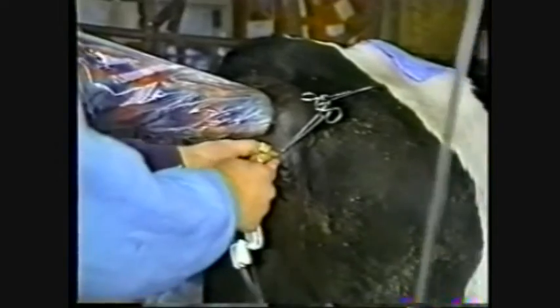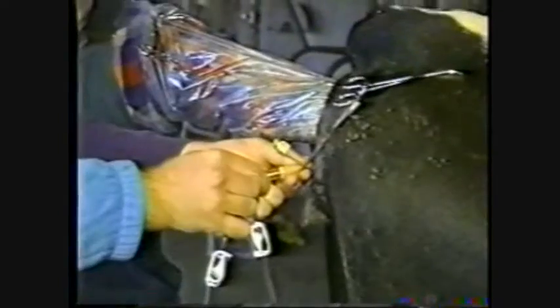Try to minimize the downward back pull on the catheter. On a downward pull with the tubing, it might dislodge and pull back the balloon. So at that stage, we're now ready to plug in the catheter to the tubing. It's good and snug, looks good.